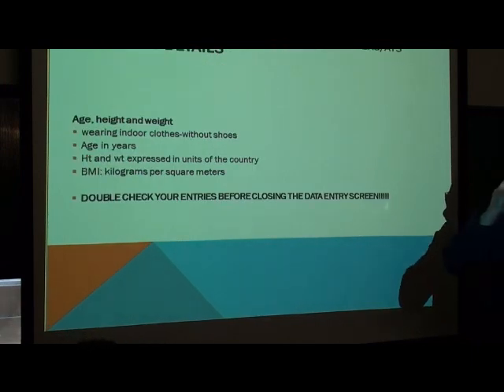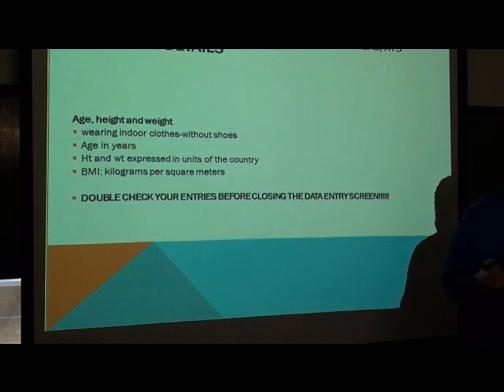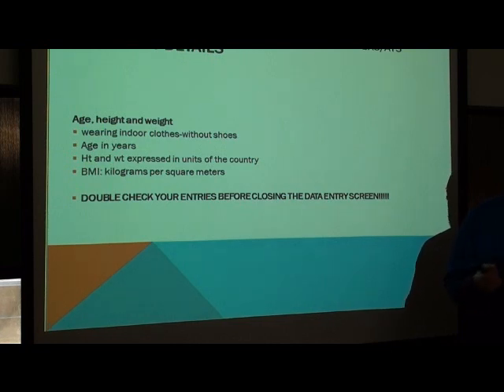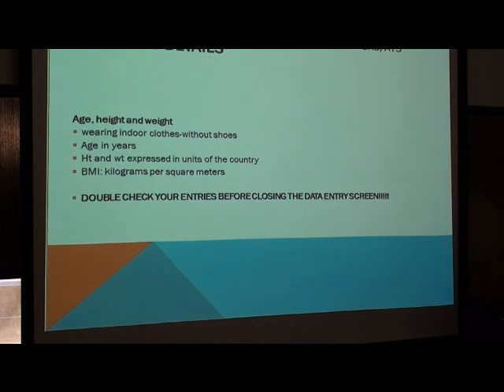So other details, and there's an important one here. We know that the predicted values, the yardstick against which the patient's results are going to be compared, are dependent upon accurate entering of the patient's gender, to a lesser degree their ethnicity, to a major degree their age and their height.